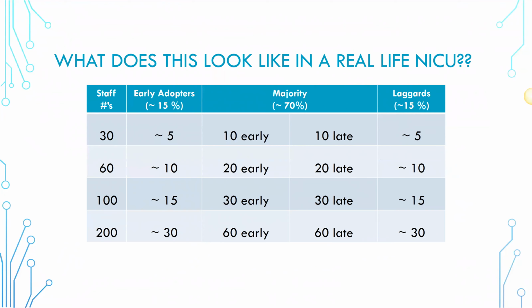And as I mentioned, there are some specific reasons why those were the areas that were chosen initially. And so those are some of the legacy decisions that were made in the 80s and 90s when Lena Hellstrom-Westas, Linda de Vries, Mona Toet, when they first started using aEEG in Sweden and the Netherlands, these were the places they selected. And so that's where most of the literature comes from. And that's why we use these locations most frequently. There are pros and cons of using other locations, but if you want to keep yourself established kind of in the history of aEEG, in the classic use, these are the locations that you'll choose.